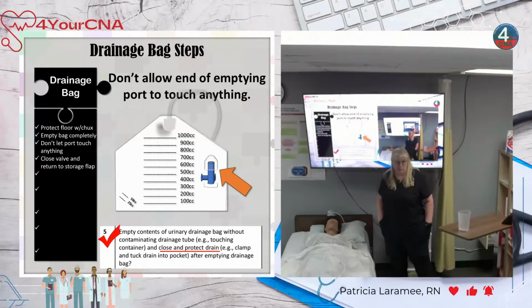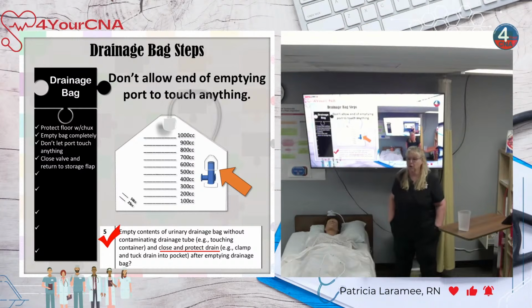We learned, because medicine is always evolving, we're learning new ways of doing things. If we didn't learn new ways of doing things, you guys would still be using leeches when you got a common cold. Okay? Medicine evolves. And what we learned was that the plastic of this port, the material it's made out of, when you put alcohol on it, it becomes very brittle and microcracks form, which is the ideal harboring place for bacteria because it's warm, dark, moist, and hidden.